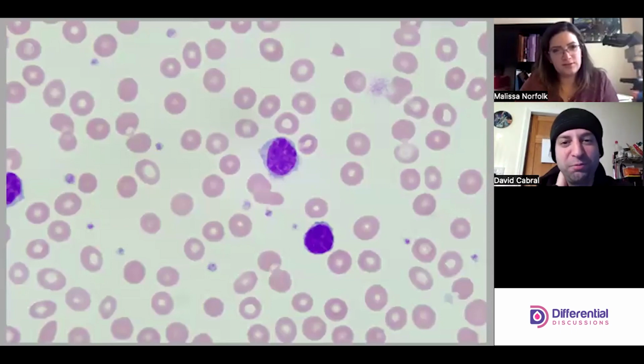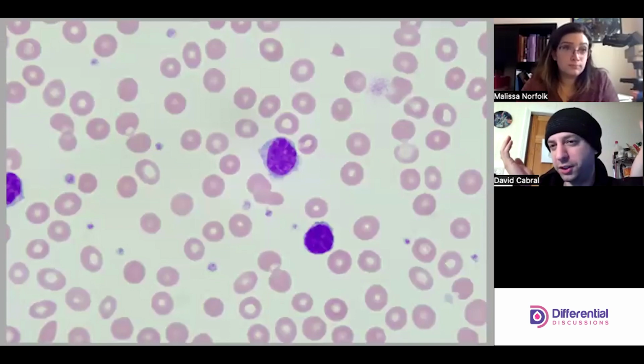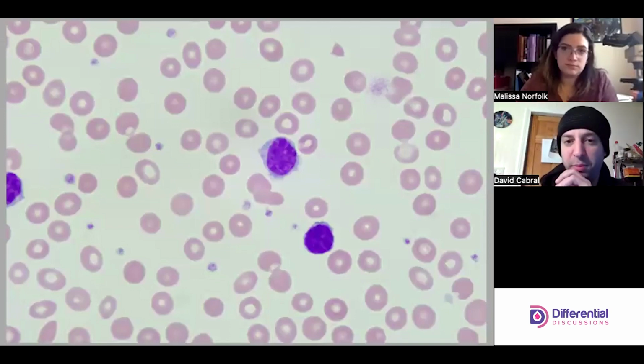So, this is a mature lymphoid neoplasm, if I remember correctly. It is. It's a mature B cell, and they're kind of messed up. A lot of times we talk about chromatin pattern in these malignancies, but in this case it's usually pretty useless. It's a mature pattern, mature cells. So now we're literally looking for hairy-like projections.